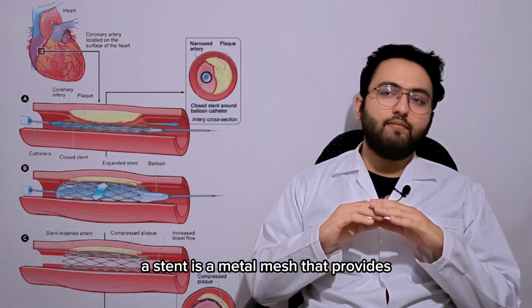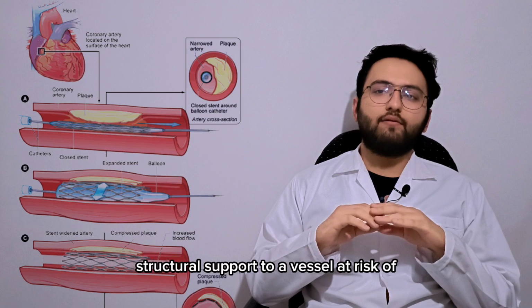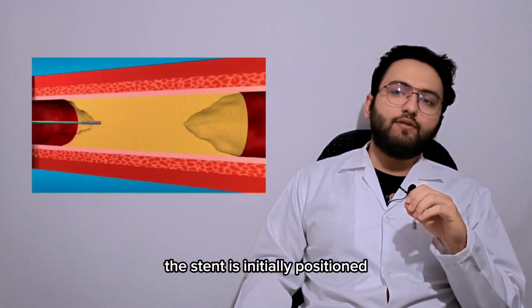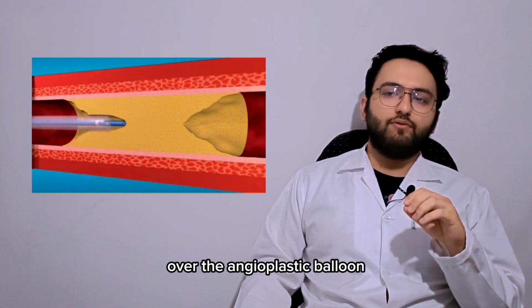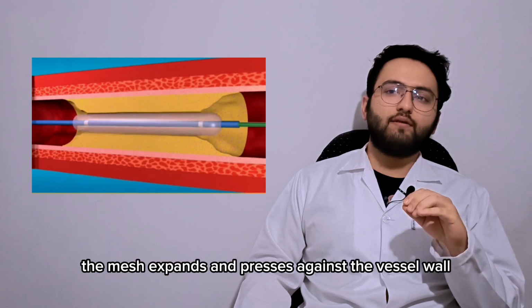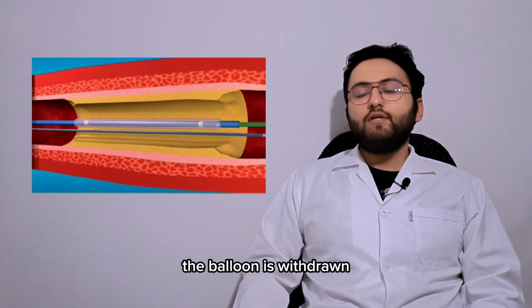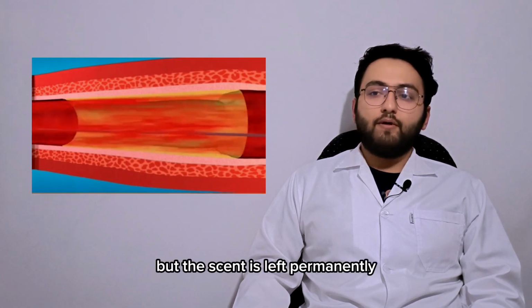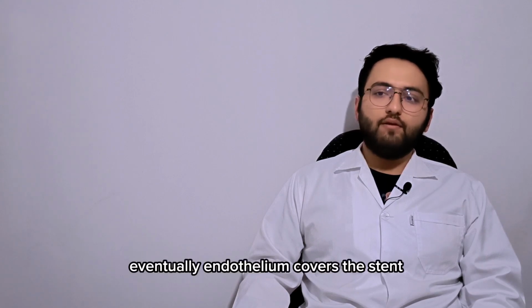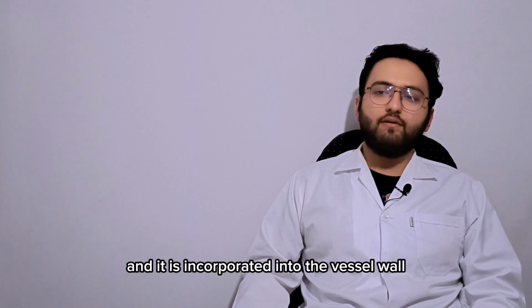A stent is a metal mesh that provides structural support to a vessel at risk of acute closure. The stent is initially positioned over the angioplasty balloon. When the balloon is inflated, the mesh expands and presses against the vessel wall, holding the artery open. The balloon is withdrawn, but the stent is left permanently in place within the artery. Eventually, endothelium covers the stent and it is incorporated into the vessel wall.